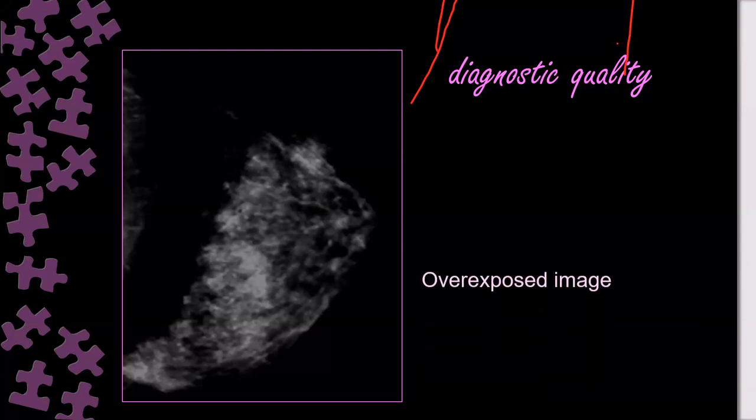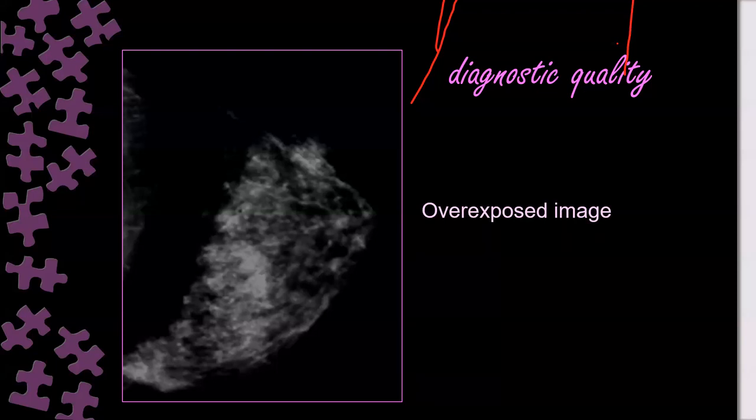Over exposure. It's black. Suhair said it is over exposure. Yes, now because she became sleepy she got confused.